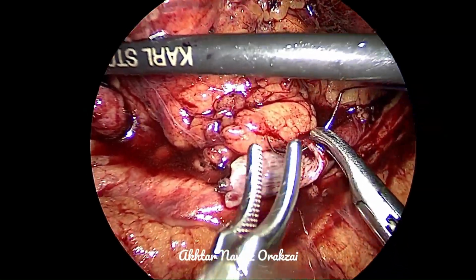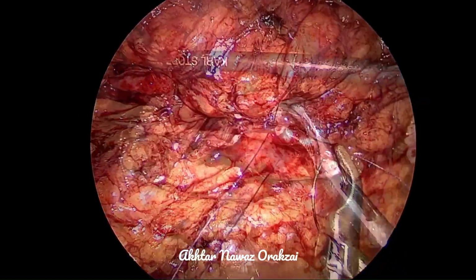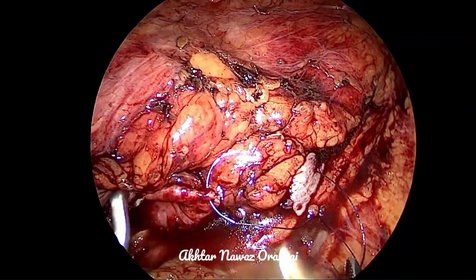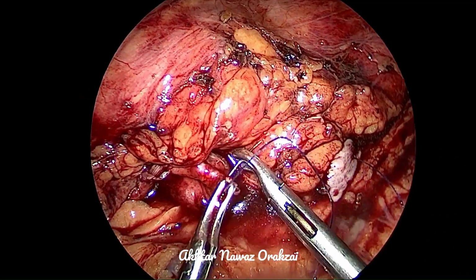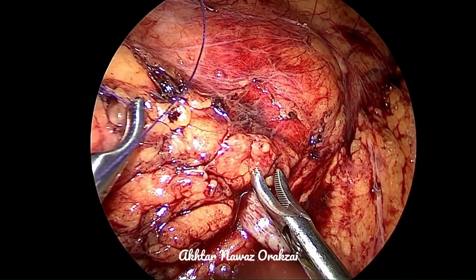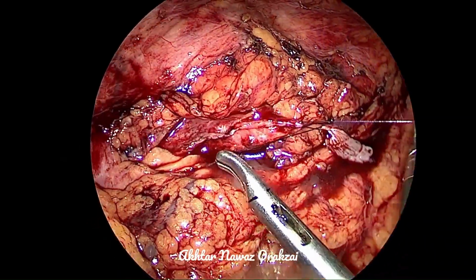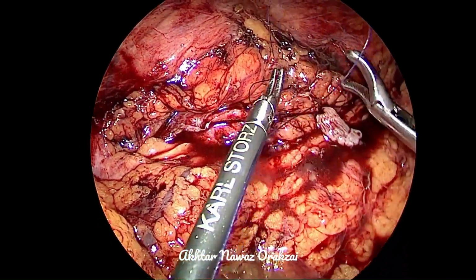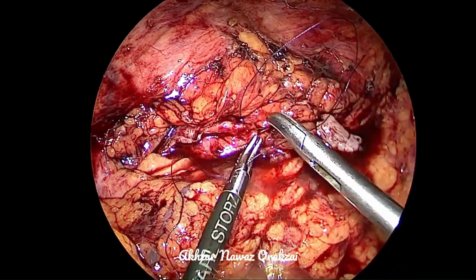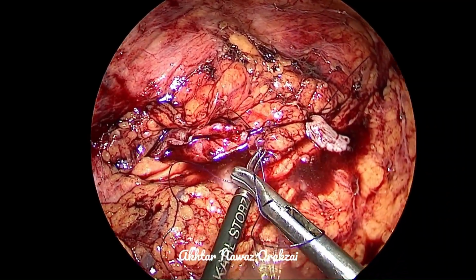We can see that we have not included the posterior wall. This is a 4-0 vicryl, outside in stitch, and then in the pelvis inside out. Now you can see the lip of the lower portion is not excised. That's why, without any tension, the 2 segments can be approximated.